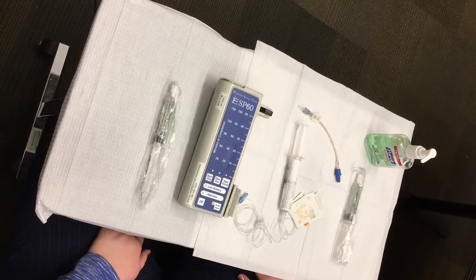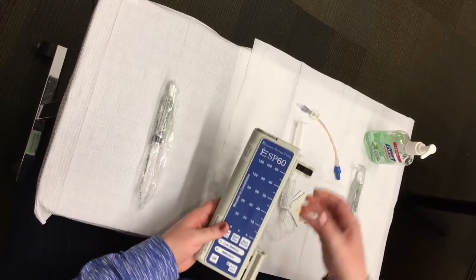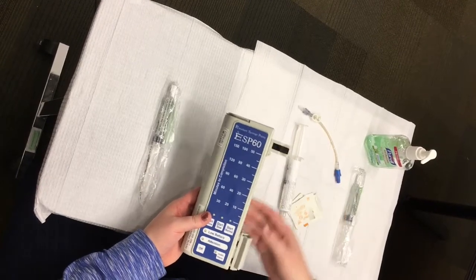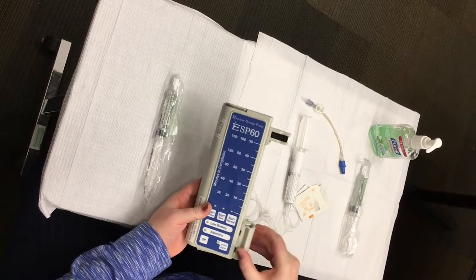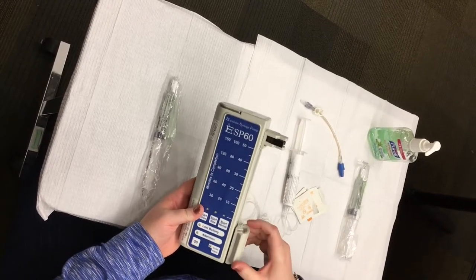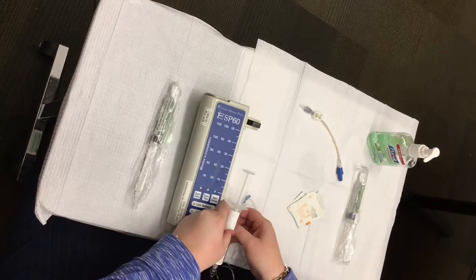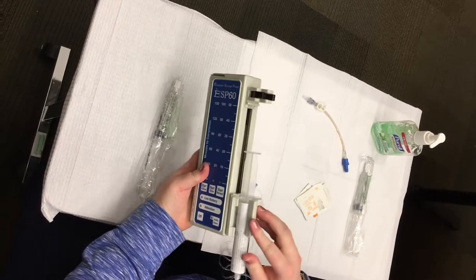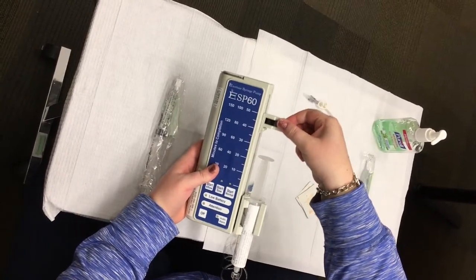Loading the medication syringe into your Excelsior syringe pump: squeeze the two black levers on the push arm together and slide the push arm up to the top of the pump. Snap the syringe into the syringe holder, making sure that the flange of the syringe fits into the slots. Then squeeze and slide the pusher arm back down to meet the end of the syringe plunger.